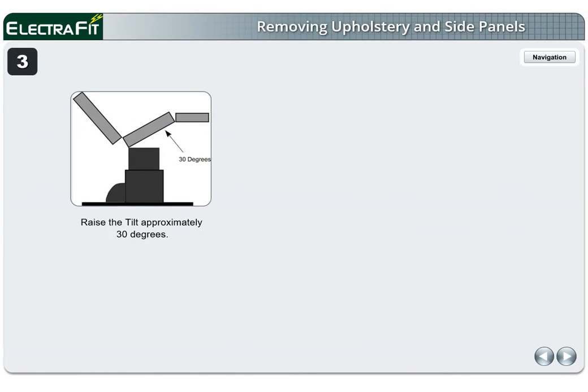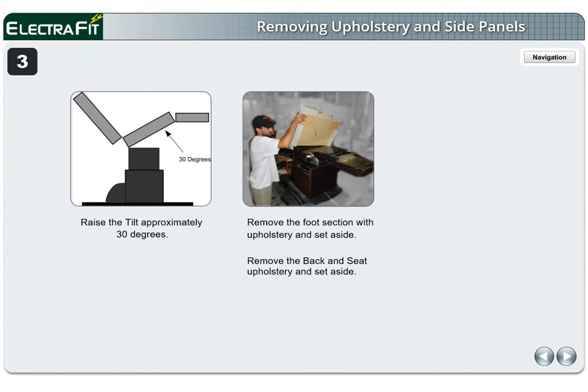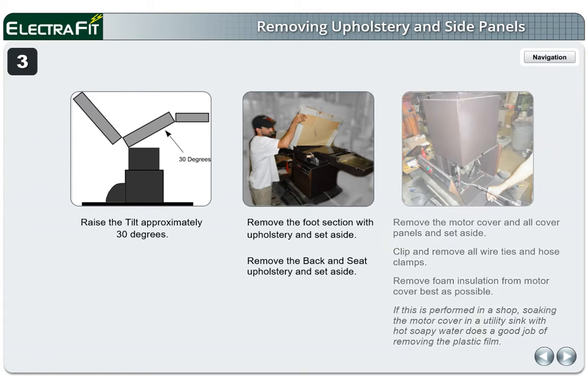Page 3. Raise the tilt approximately 30 degrees. Remove the foot section with upholstery and set aside. Remove the back and seat upholstery and set aside. Remove the motor cover and all cover panels and set aside. Clip and remove all wire ties and hose clamps. Remove foam insulation from motor cover as best as possible. If this is performed in a shop, soaking the motor cover in a utility sink with hot soapy water does a good job of removing the plastic film.